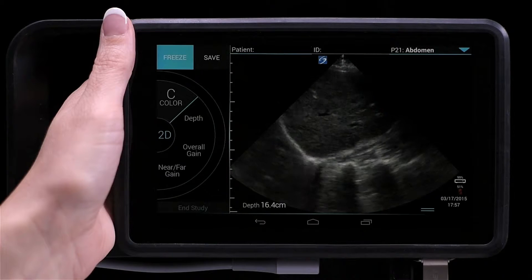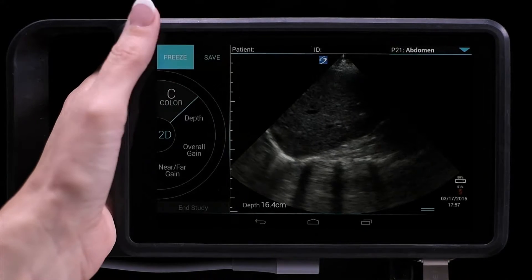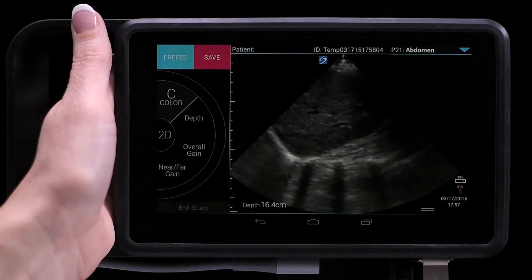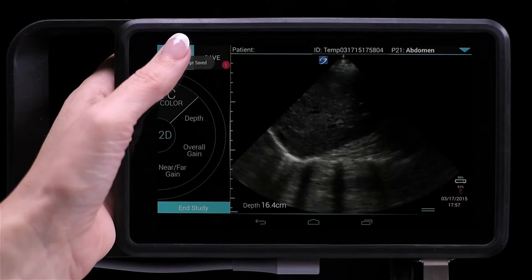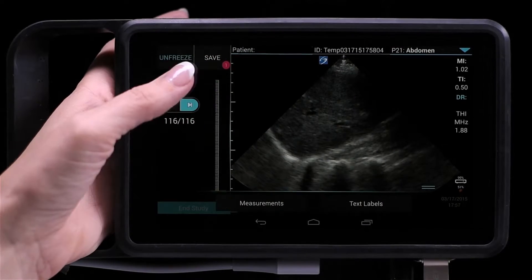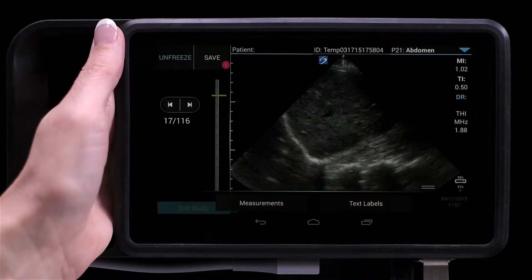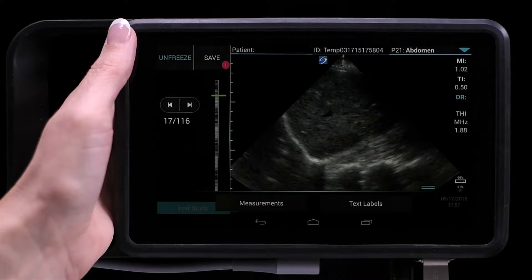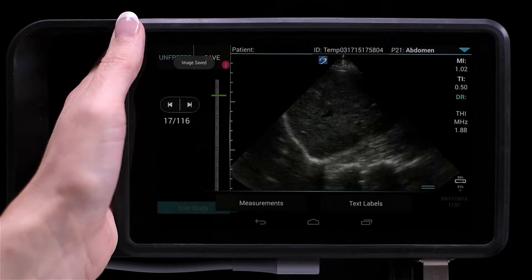To take an image, simply tap the save button, or you can freeze the image and scroll through the cine buffer to go to the appropriate image, then tap Save. Images are saved in both DICOM and JPEG formats.